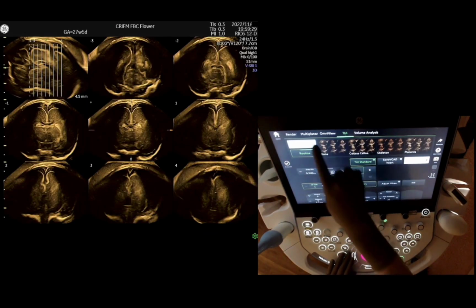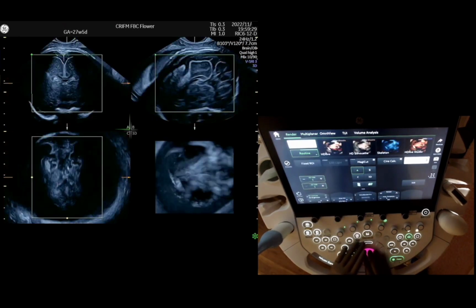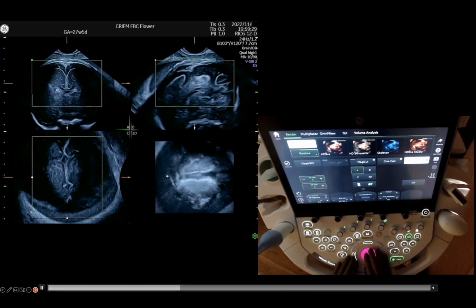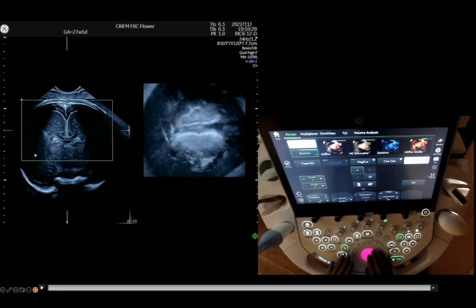But what about the ultrasound window in the image where the acoustic shadow due to the cranial bone made it difficult to see the brain, as I've shown earlier? You cannot recognize the anterior fontanelle. Instead, this is the sagittal suture, which is not wide like the anterior fontanelle. Therefore, the acoustic shadow makes most of the brain structure hidden and black.